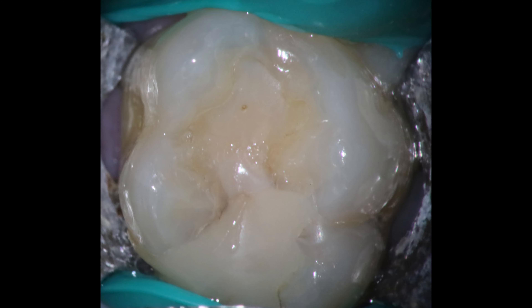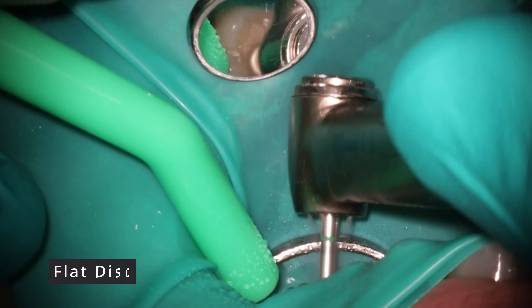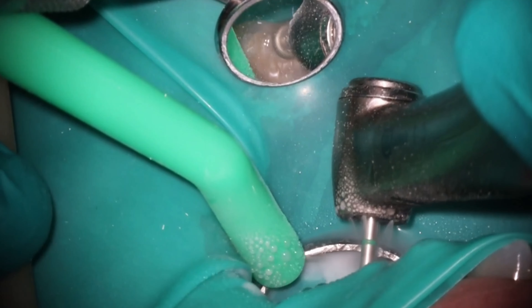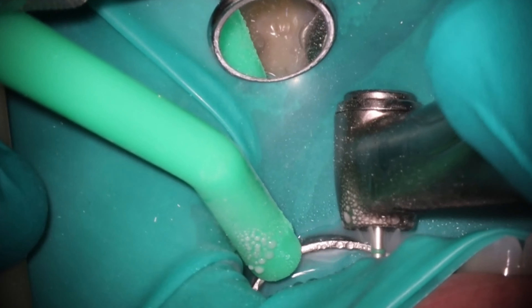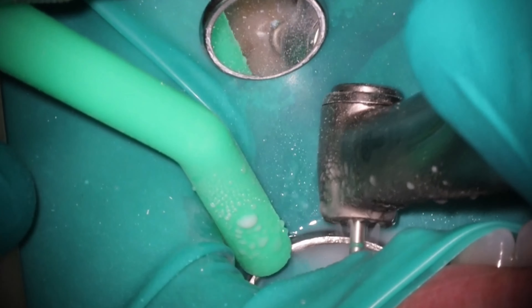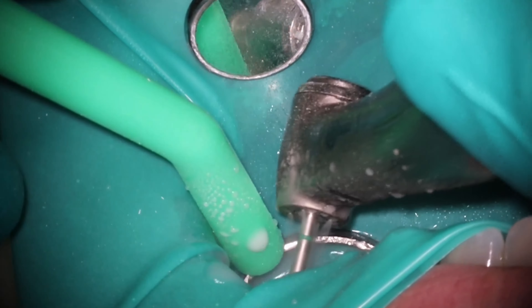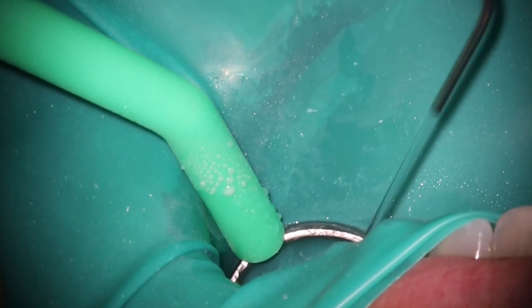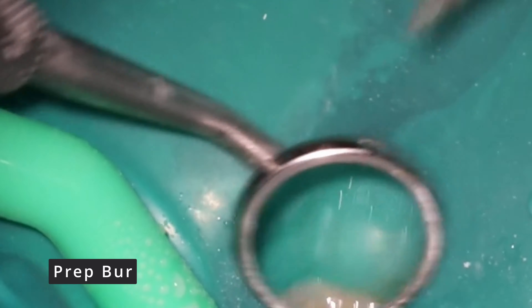Let's go ahead and start off like we always do by taking the tooth out of the bite. This one will end up in a crown, so may as well remove all those interferences. I like to do this on all my cases where I know it's going to have a crown — just make the tooth flat. Give it implant occlusion from the beginning because you're going to have far less issues with post-operative pain. It's one of the best things you can do here.